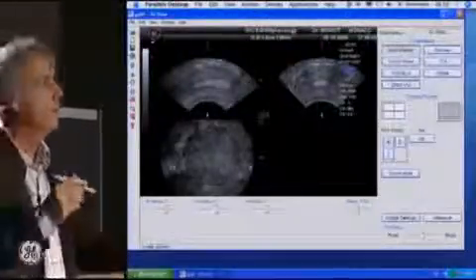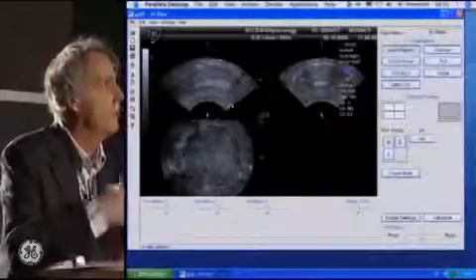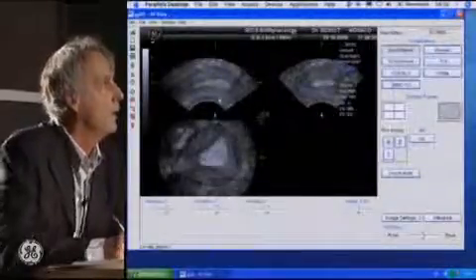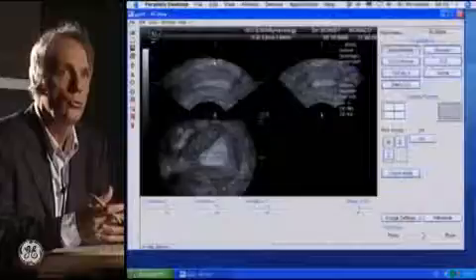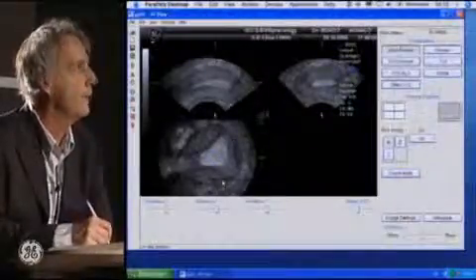I will open some cases in gynecology and show you how we can work with a block. First, I start with the gynecology. What is this? This is the uterus just before menstruation, just before the period, and you can see the endometrium is white, and it is the best time to do 3D of the uterus because you can clearly see the uterine cavity.